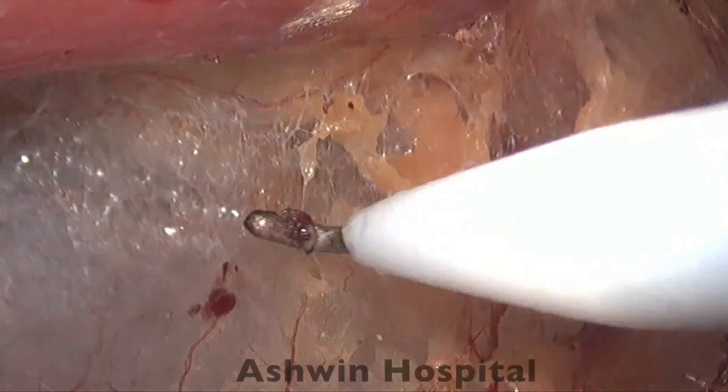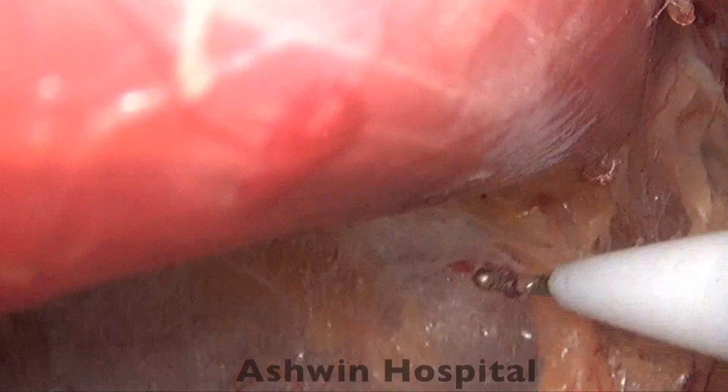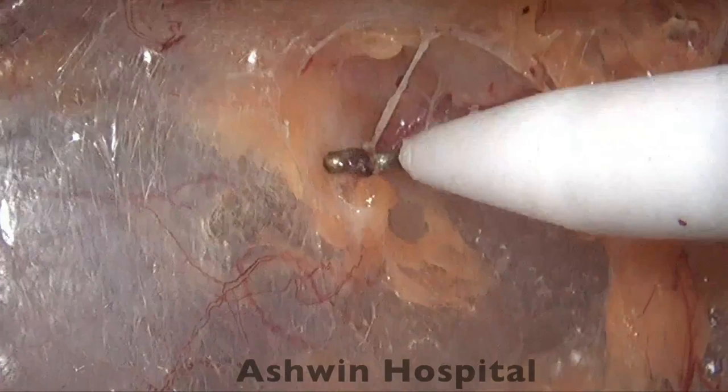You can see the muscle quite bare. So once again, we try to retain a small fascia. That's why we are not going too anterior close to the muscle. Rather, we are working a little lower. And here you can see, as we are carrying our dissection a little more, the Cooper's and the pubic area would come and become more visible. Once again, you can see some fat which is present that has to be retained with the anterior abdominal wall. We should not try to dissect above it.